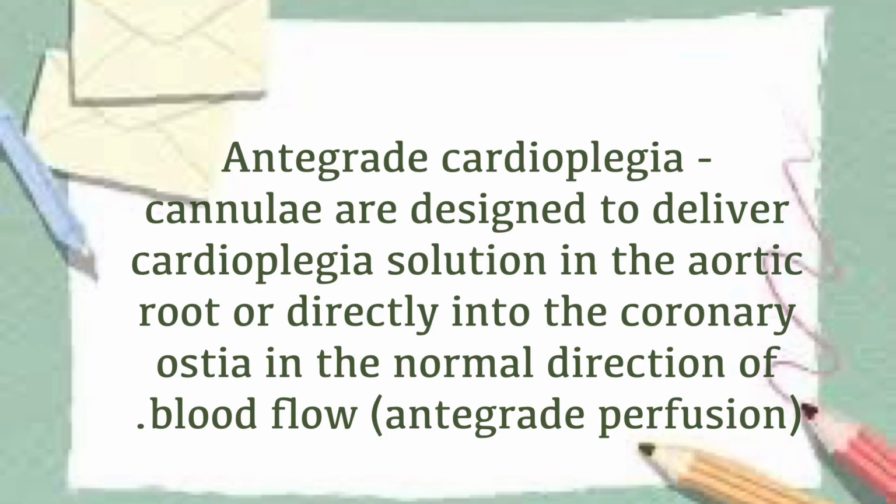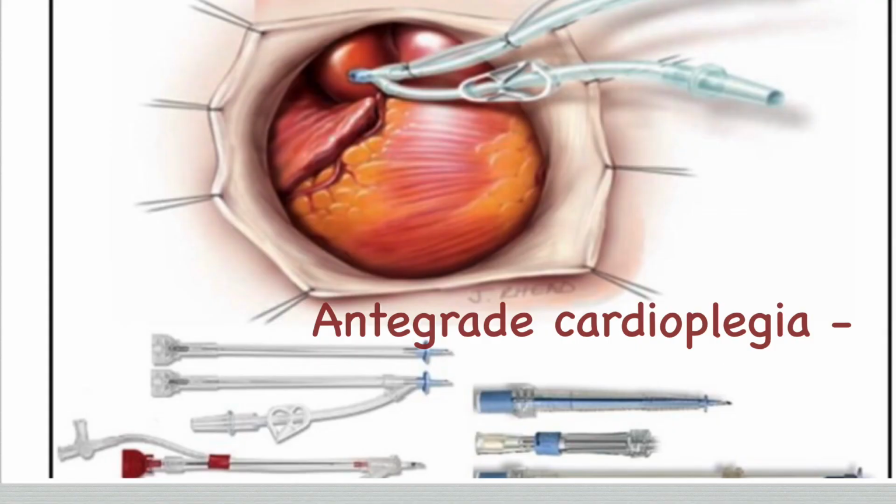Antegrade cardioplegia cannulas are designed to deliver cardioplegia solution in the aortic root or directly into the coronary ostia, in the normal direction of blood flow. Antegrade cardioplegia cannula insertion is shown in this figure.